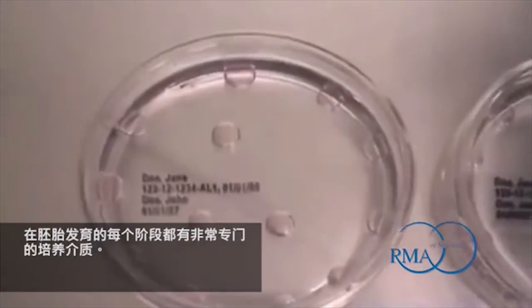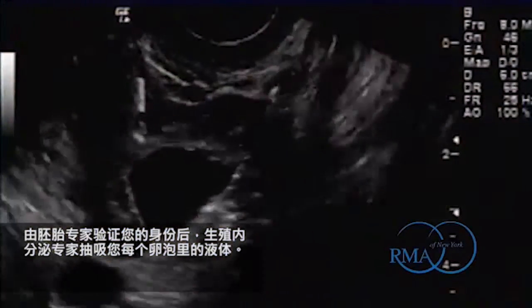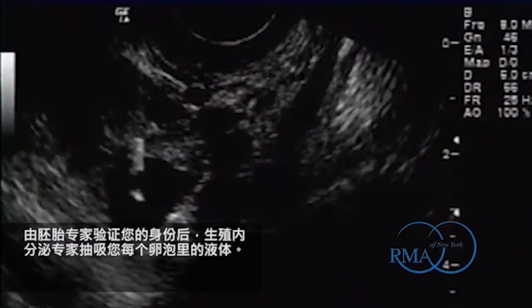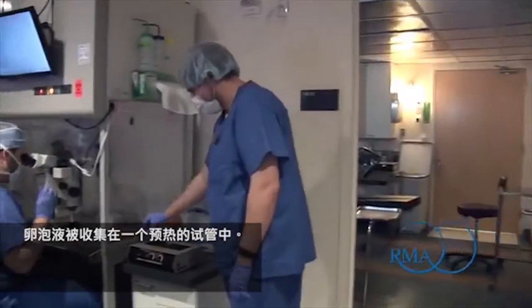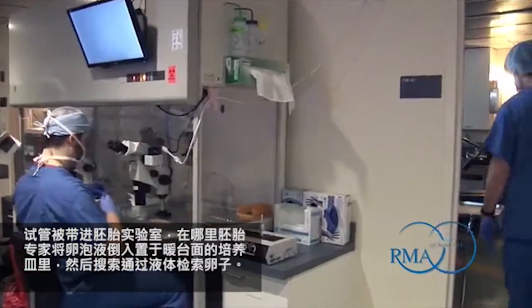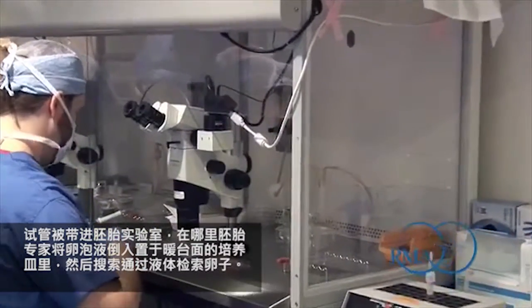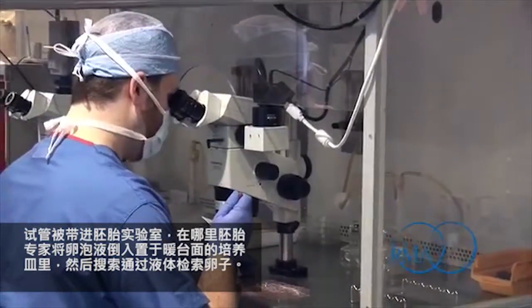The cultured media is highly specialized for each stage of embryo development. The first procedure most patients undergo is an egg retrieval. After your identity is verified by an embryologist, a reproductive endocrinologist aspirates the fluid contained in each of your ovarian follicles. The follicular fluid is collected in a pre-warmed test tube, which is brought into the embryology lab where an embryologist pours the fluid into a dish located on a warm surface and then searches through the fluid to locate the eggs.